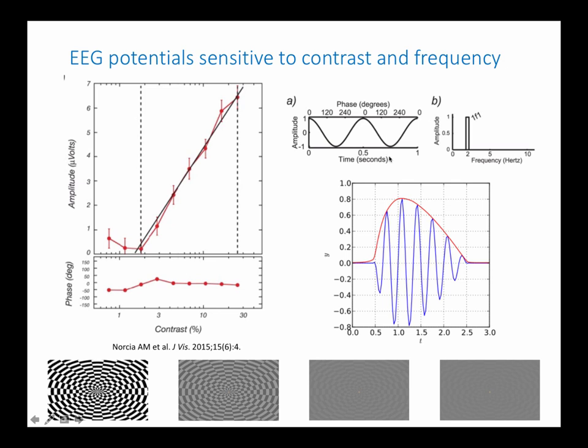Same thing if you also detect that at one specific frequency. So you can imagine modulating the contrast and just detecting the envelope of that change. And then you can do the same task in fMRI and EEG and bridge the difference between the fMRI being really slow and the EEG being very sensitive and very fast. So you can have a fast stimulus, but also image it the same way in both modalities.